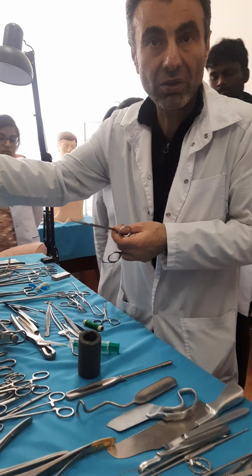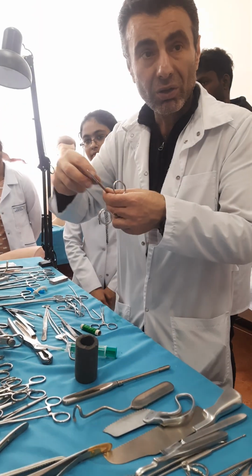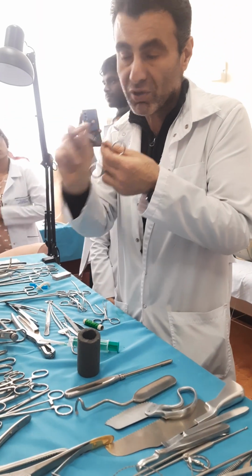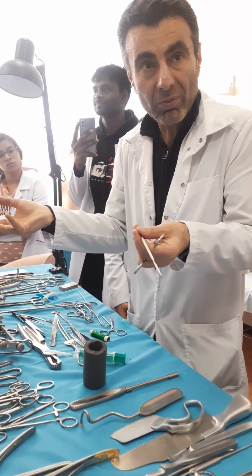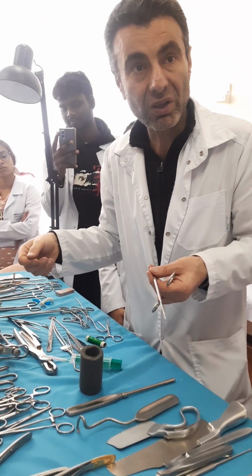And then I insert the tubular structure. In our pharmacies, you can even buy a tube with a sharp tip, for emergency manipulation. So at that point, you perforate it and you insert it.